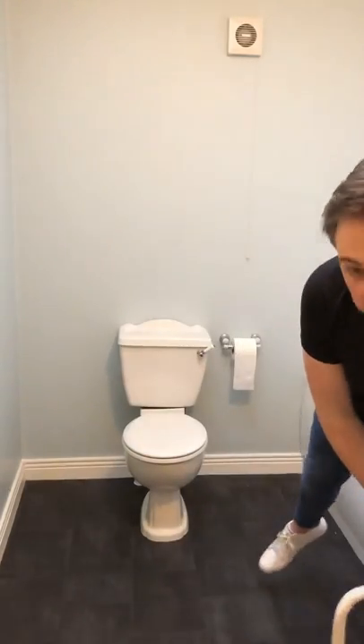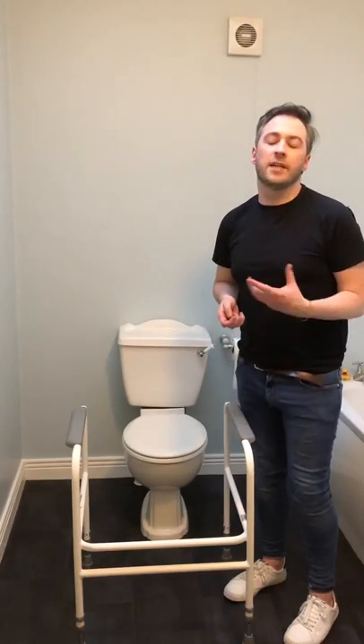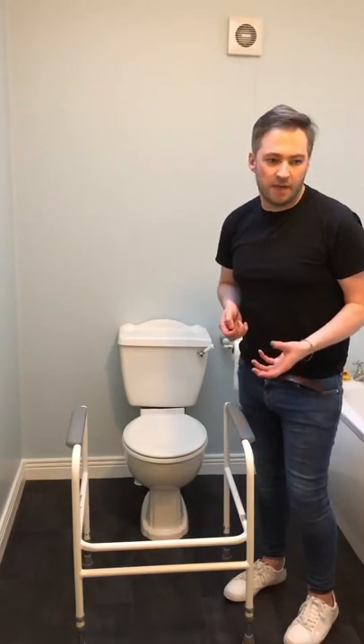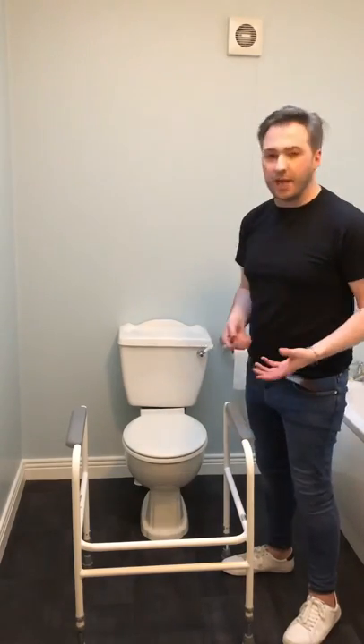Hi, today I'm going to show you how to set up a toilet surround frame. This piece of equipment is used to help clients get up and down from the toilet when they might not necessarily need a raised toilet seat. It can be used in combination with a raised toilet seat or it can be used without.